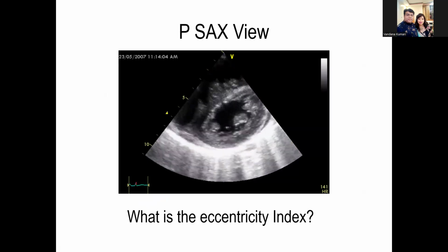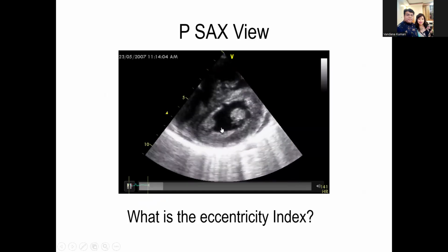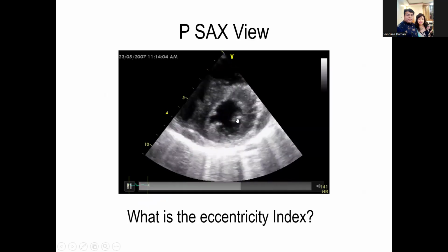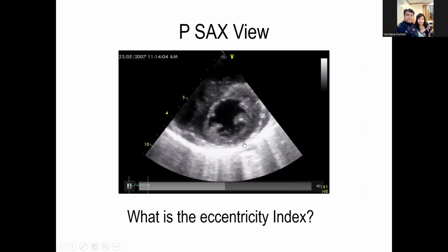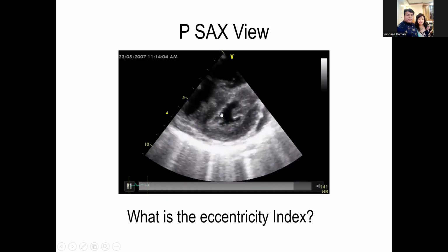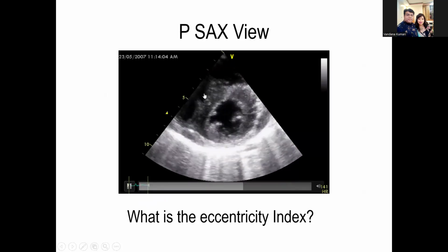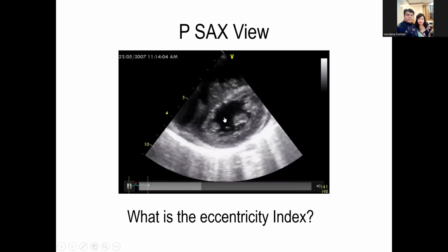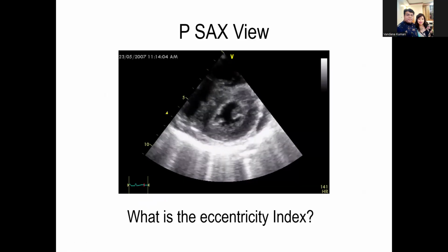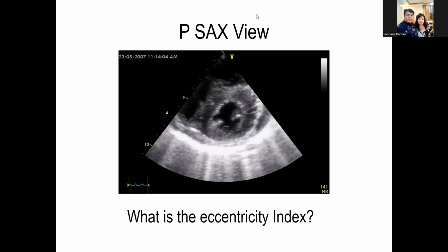So if you look for this kind of phenomenon, the best answer, if you really want to be sure about it, is to put a cursor line across it in M mode. Then scroll your ECG from diastole to systole, systole to diastole. If this segment goes down further, it means we are dealing with pressure. Clear? Yes, sir. Understood.